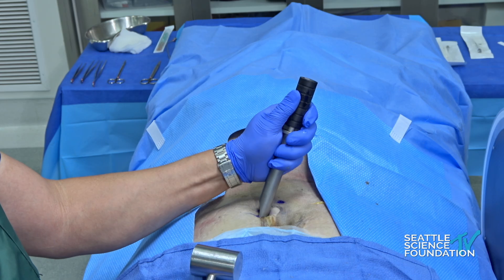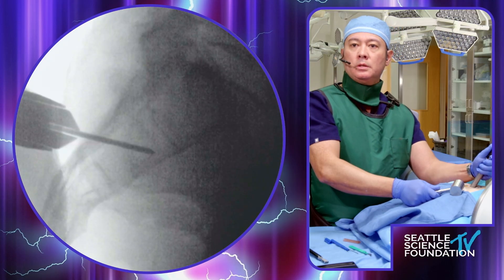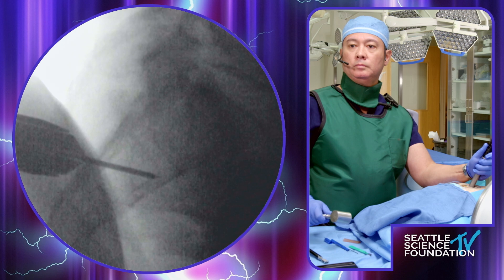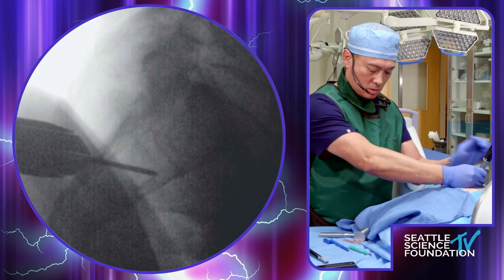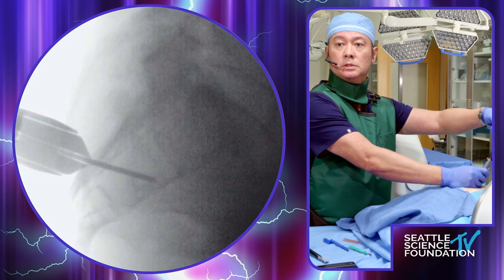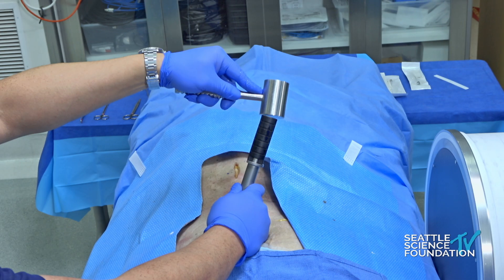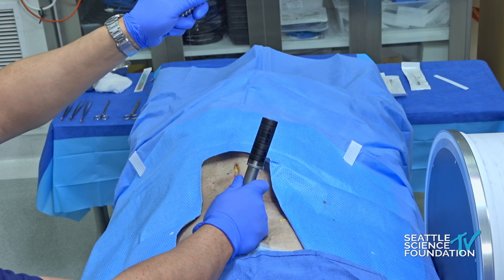Pain Tech has done a nice biomechanical study showing that putting the allograft in this area will help provide good biomechanical advantage, giving it good purchase and function from the joint. I feel pretty safe with this because the cannula itself has that safeguard and hard stop for the ileum and sacral side.